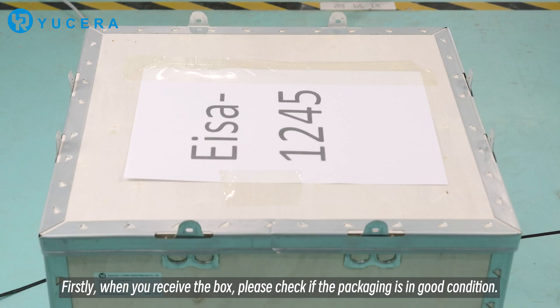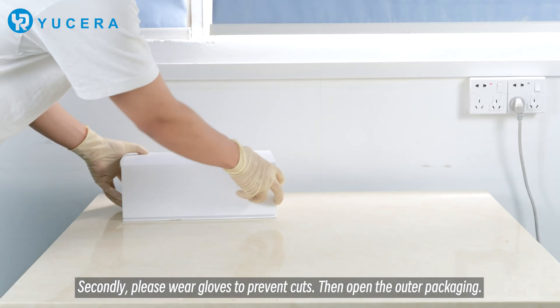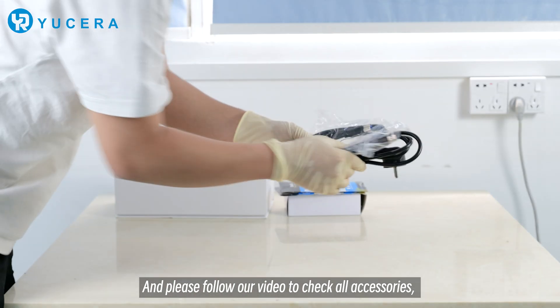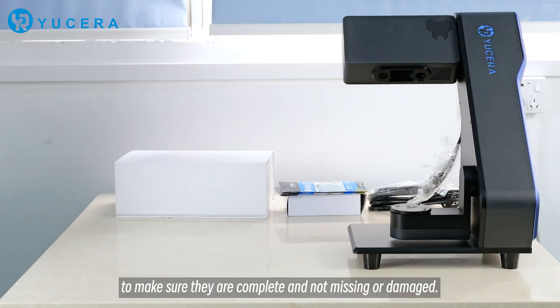Firstly, when you receive the goods, please check if the packaging is in good condition. Secondly, please wear gloves to prevent cuts, then open the outer packaging, and please follow our video to check all accessories to make sure they are complete and not missing or damaged.